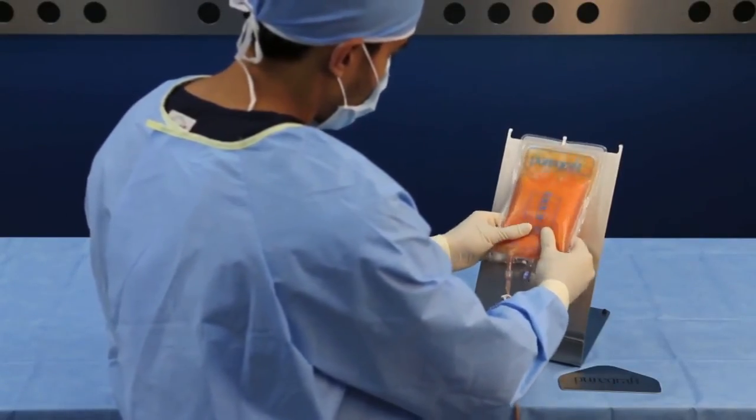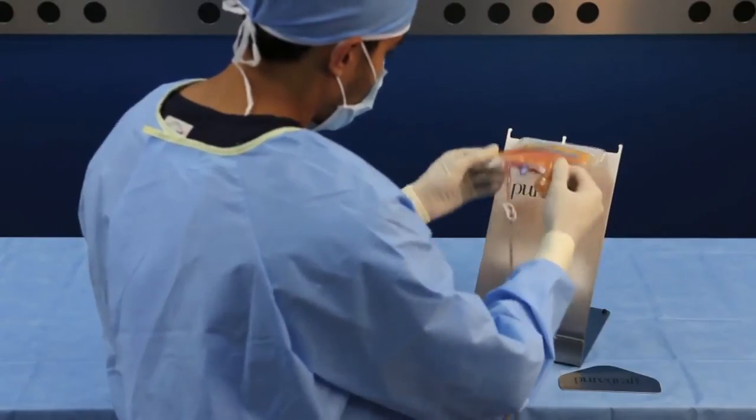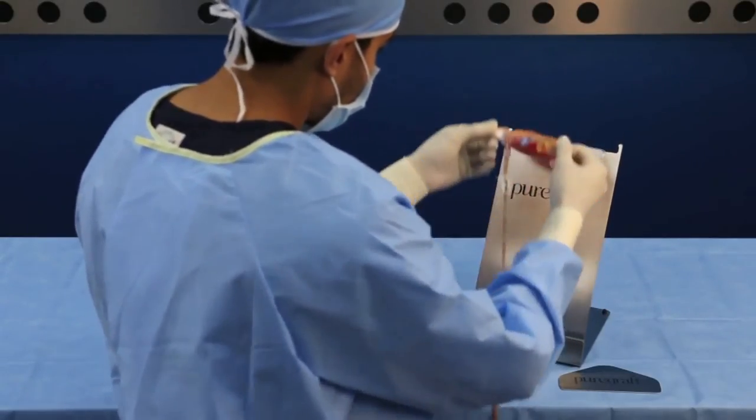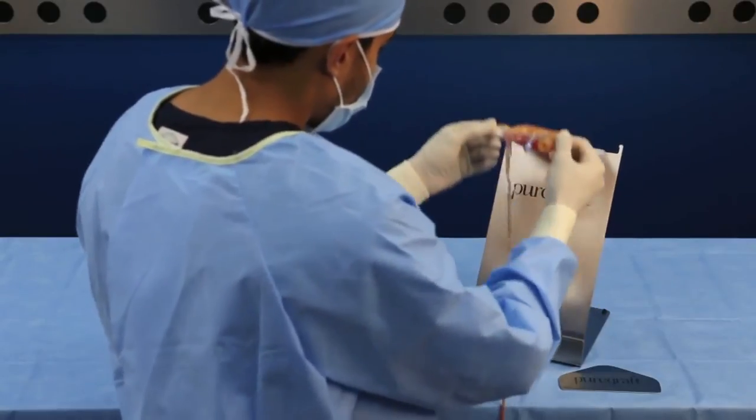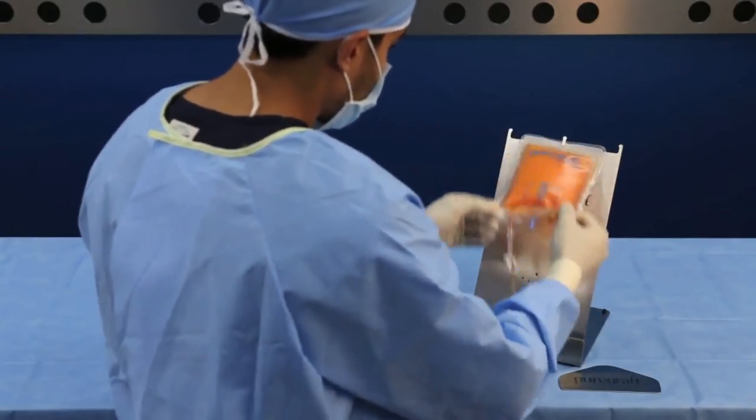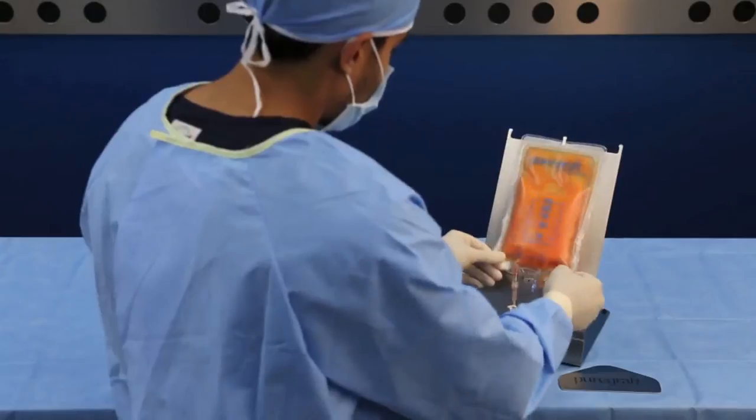Two proprietary filtration membranes line the length of the inside of the PureGraft. Tissue stays on one side, and only fluids, free lipids, blood cells, and other contaminants pass through the membranes and into the drain bag.